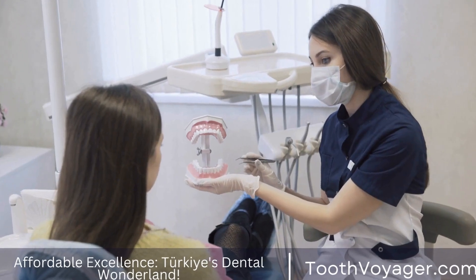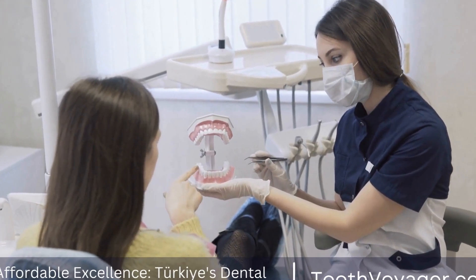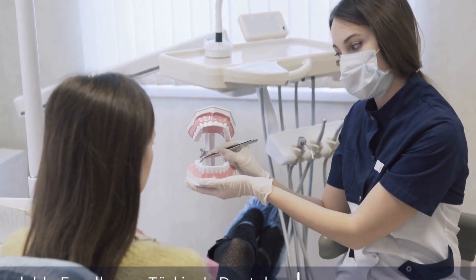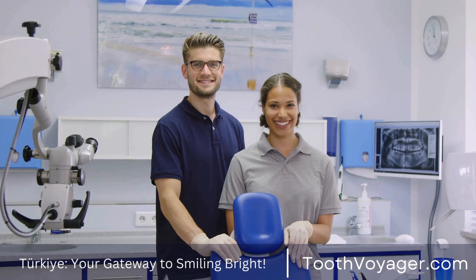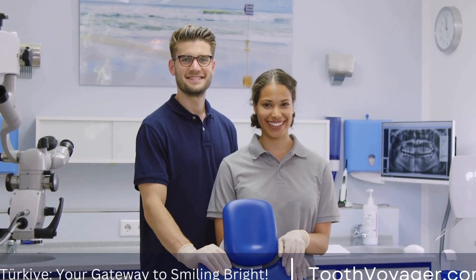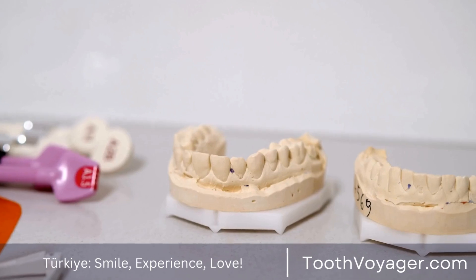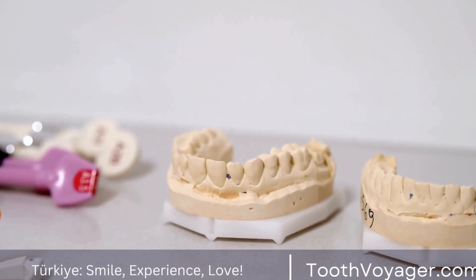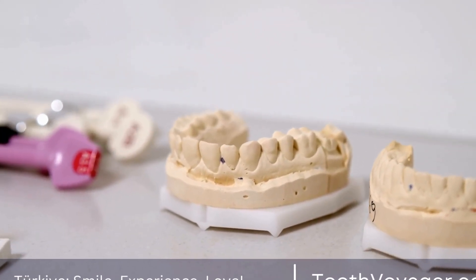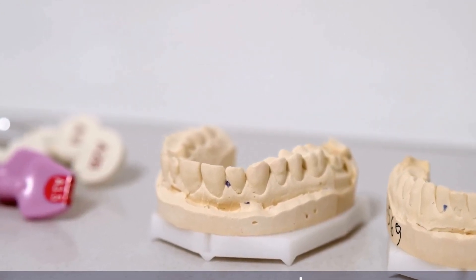Denture manufacturing is an essential procedure in dental care that requires making custom prosthetics that ensure the greatest satisfaction for patients. Dentures can be used as replacements for missing teeth as well as their surrounding tissues. They are essential in the restoration of oral function as well as aesthetics for those who have lost their teeth for different reasons like dental decay, trauma, or the aging process.